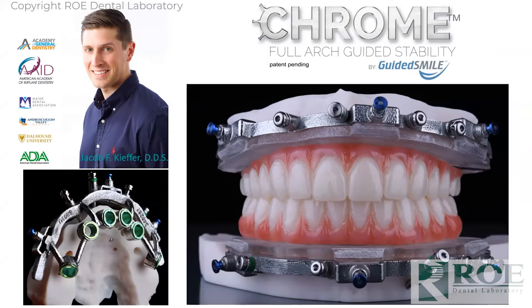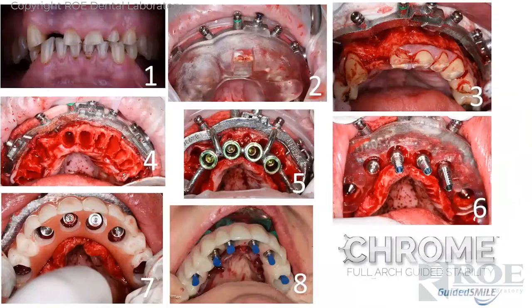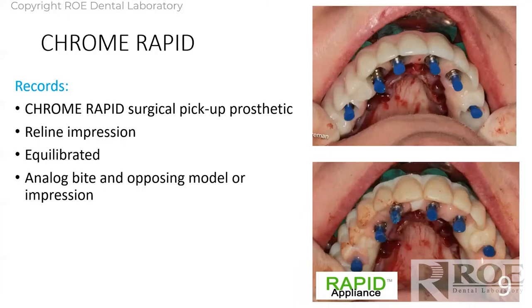This is guided surgery where we are controlling the bone reduction, implant placement, temporary cylinder pickup, and prosthetic delivery all in a few hours. On the day of surgery, you do two pickups. The top one is the patient's take-home prosthetic that they're going to wear, and the bottom is called the rapid appliance — it's a second pickup. Traditionally that rapid appliance is held at the office. In six months, the patient comes in, the long-term prosthetic is taken out, the rapid appliance is seated, it's equilibrated and you can do a reline impression, take a bite and an opposing, and you could go right to final.